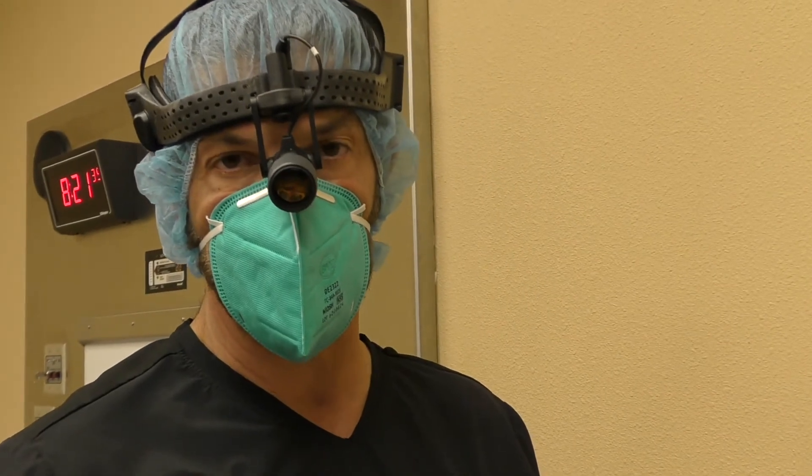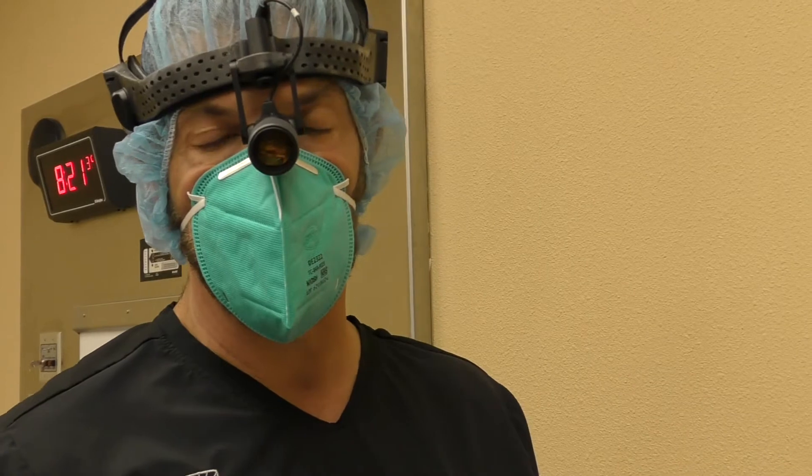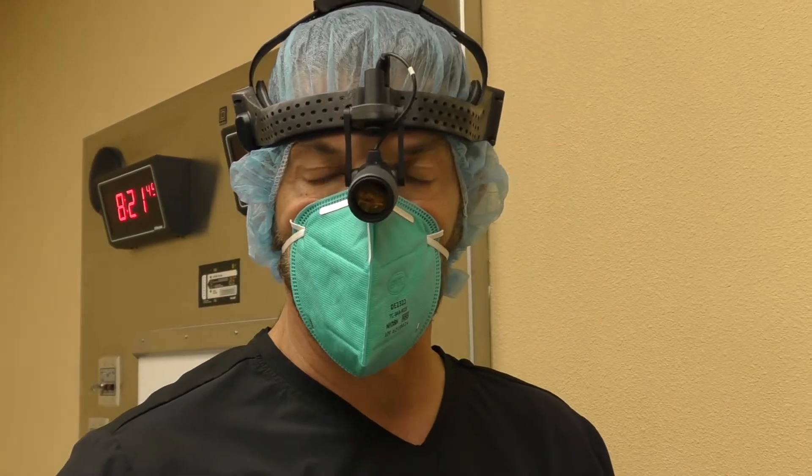There are three sizes to the implant: a three millimeter, a four millimeter, and a five millimeter. We're going to use the five millimeter on both the upper and lower lip. There are also different lengths and we've pre-measured that. So we are ready to get started.